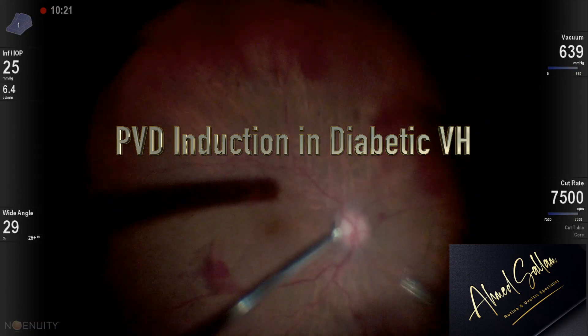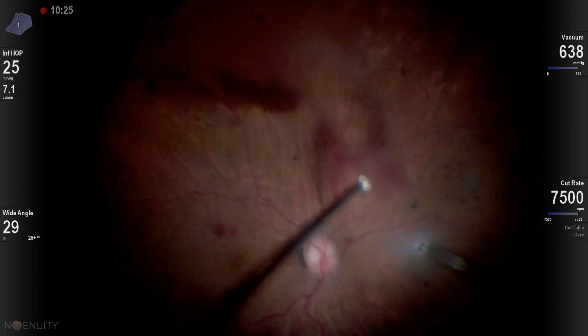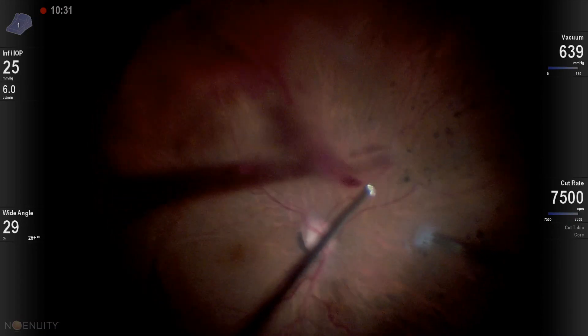This is a short video on PVD induction and diabetic vitreous hemorrhage. Diabetic vitreous hemorrhage is different from other vitreous hemorrhages in that there is strong attachment between the vitreous and the retina at epicenters.